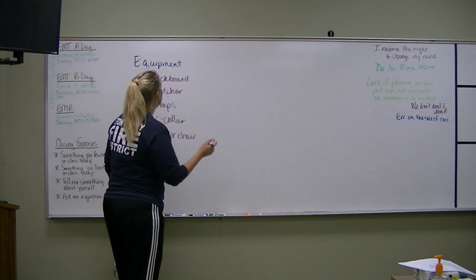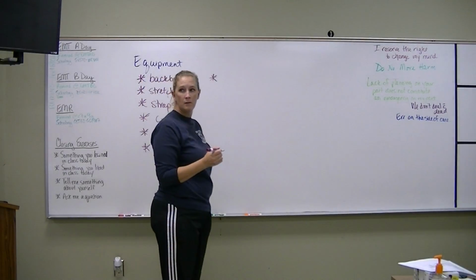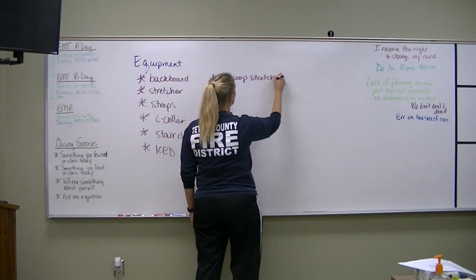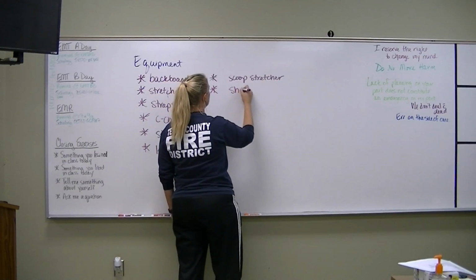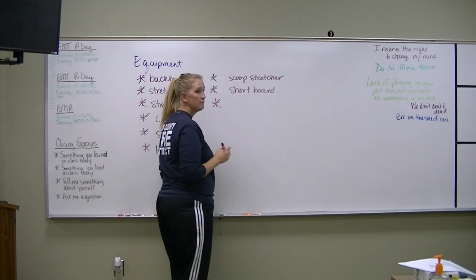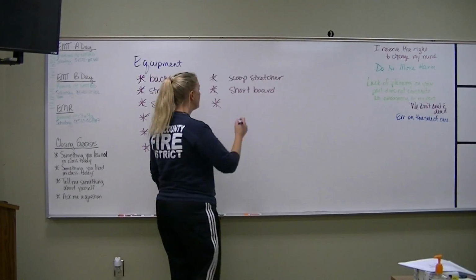Okay, what other types of equipment do we have? Orthopedic litter. Scoop stretcher. Short backboard. Blanket.